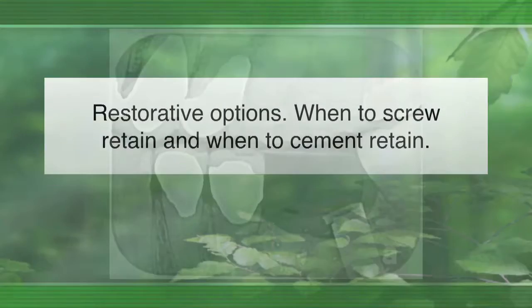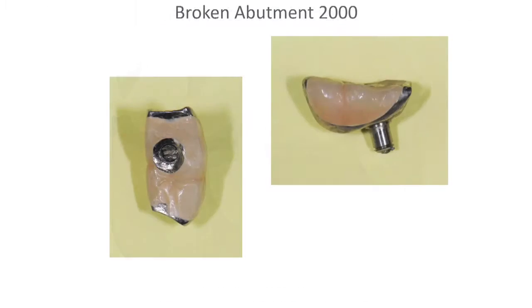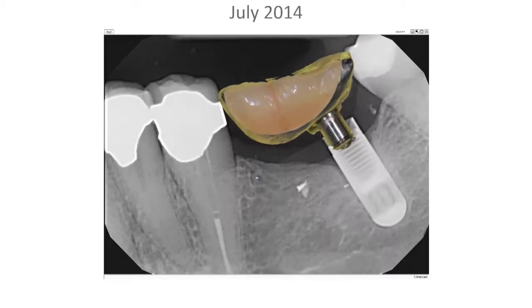So when do you use screw retained and when cement? Here's a good case that came to me in 2000. Here's a screw retained.